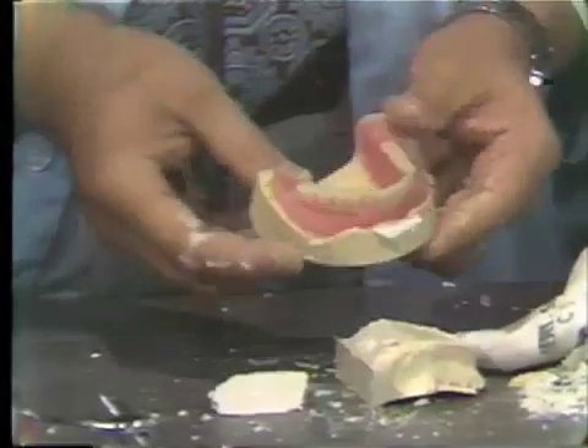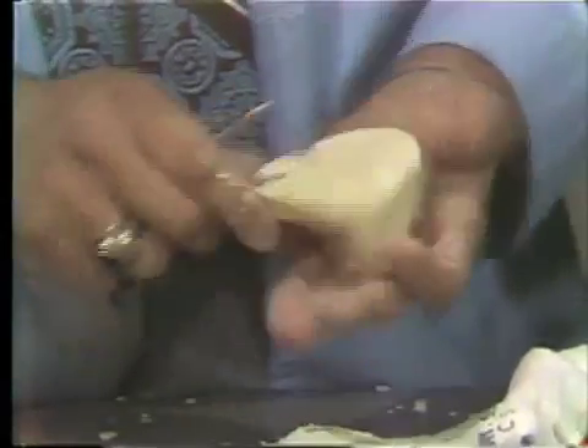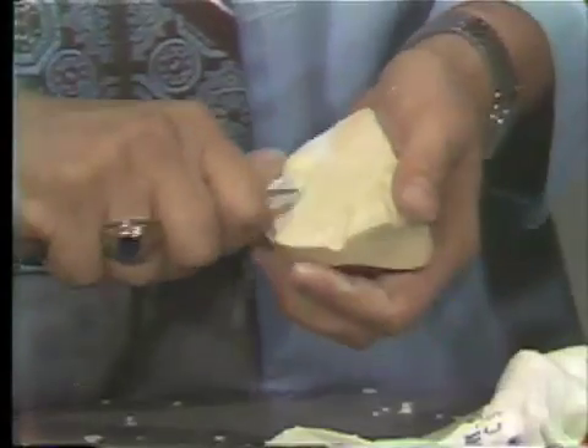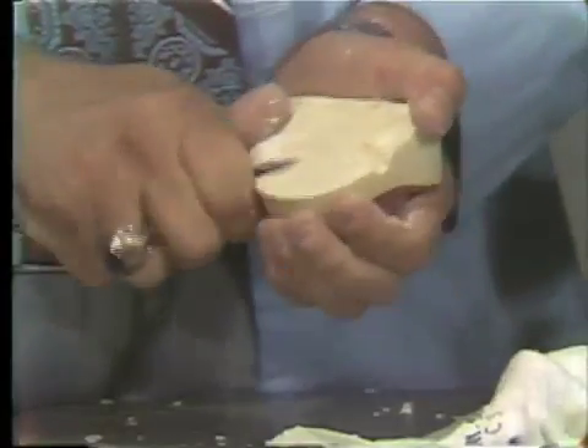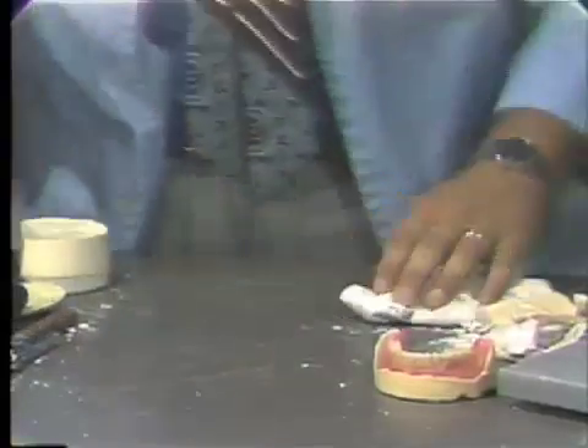Now you see we have retrieved the denture still attached to our master cast. At this point, you can go back and remove all the excesses from the master cast and clear out the grooves. I'm going to set this one aside while I do the maxillary denture. This is a messy procedure, and you'd like to do it in a work area that's designed to work with plaster.